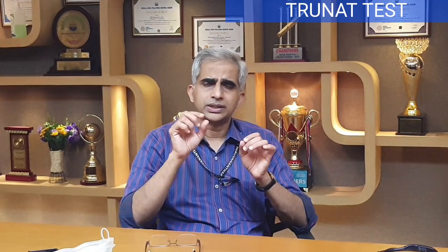What is TrueNat? TrueNat is an Indian company. It uses a real-time PCR format with reaction tubes — microcentrifuge tubes or 12-strip formats. The advantage of TrueNat is that it is a chip-based system using a disposable chip.